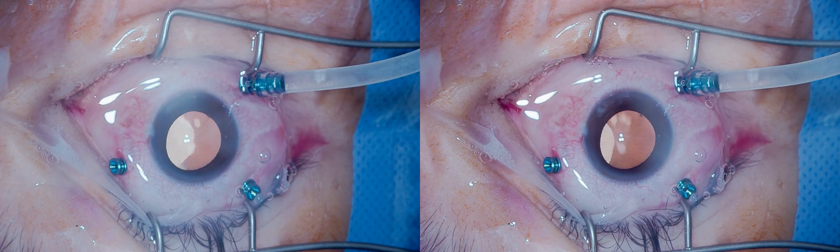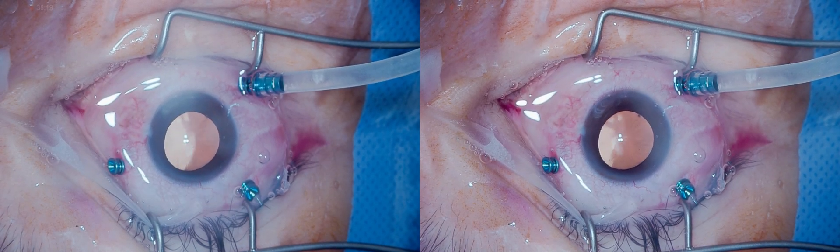The laser is carefully applied to the retinal periphery, ensuring the lens is avoided and the eye is moved accordingly. A 360-degree laser is then used to create a protective barrier around the entire periphery. The lens stays clear at all times and the laser is applied right on the spot where the retinotomy was made. Three rows are given to create a very strong protective barrier.